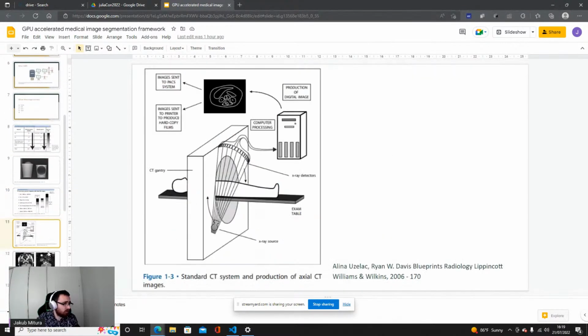Okay, this one you already know. Yes, in the case of the CT scan, what is also important is that we can view 3D images. Yes, we can do 3D images, but in truth, those 3D images are made because we have a lot of 2D images. We'll get deeper into it in a moment, particularly into CT scans, so I will concentrate on this for a moment.